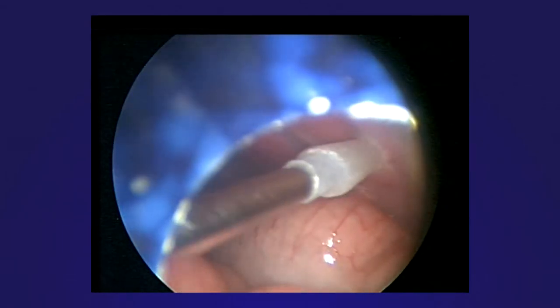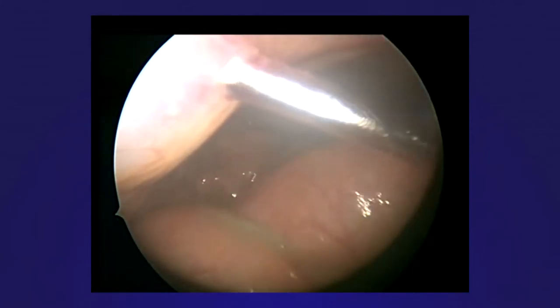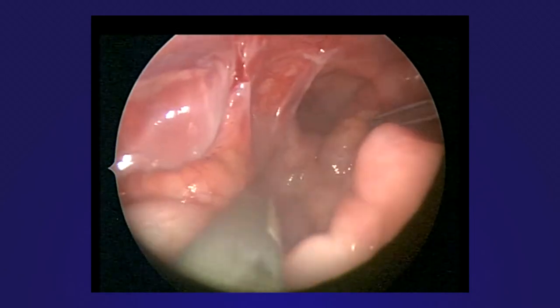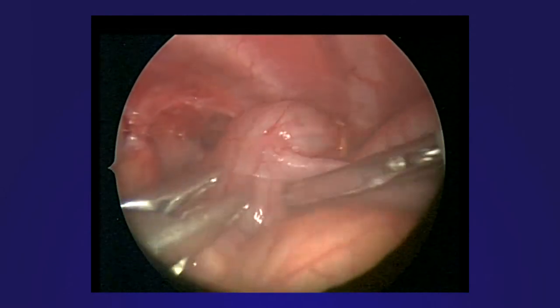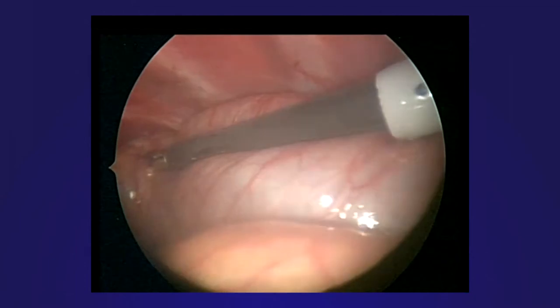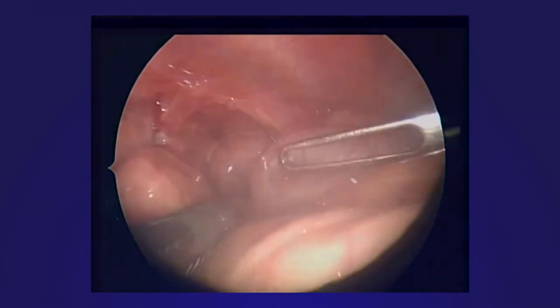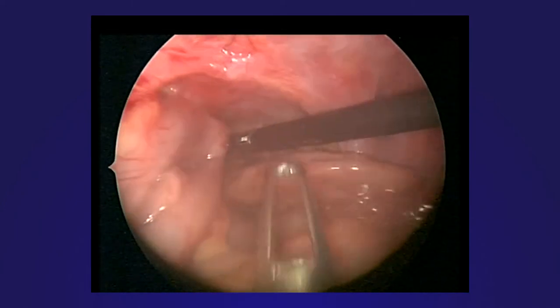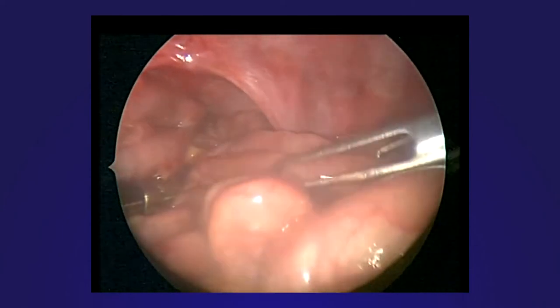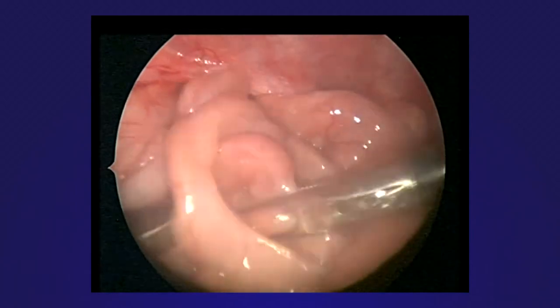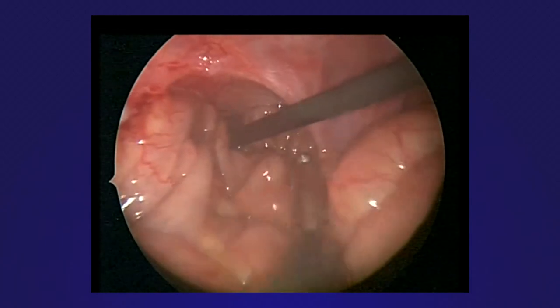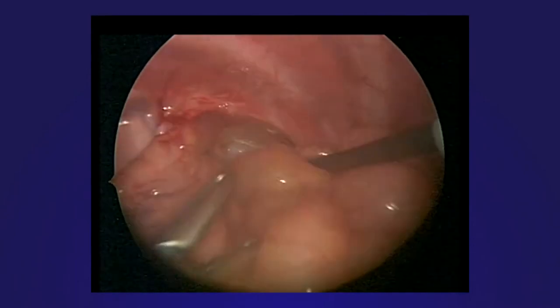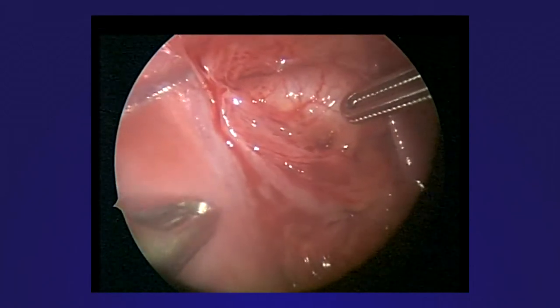A 5 mm step trocar is inserted anteriorly and a similar trocar is inserted posteriorly. The colon is reduced first, followed by bimanual reduction of the small bowel using two atraumatic graspers. Complete reduction has been achieved.